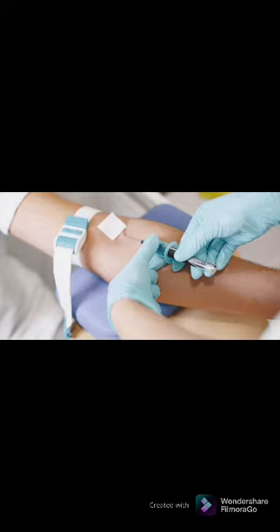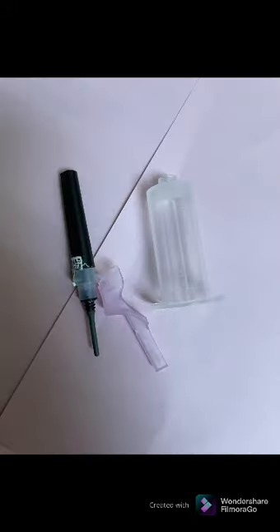Reapply the tourniquet, uncap and insert needle. Ask patient to remake the fist, anchor and insert the needle. Anchor the vein and insert the needle. Establish blood flow. Release tourniquet and ask patient to open fist. Fill, remove, and mix tubes in order of draw.